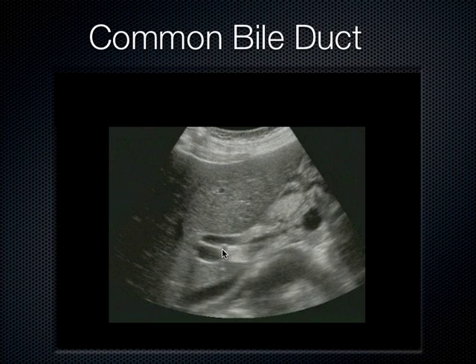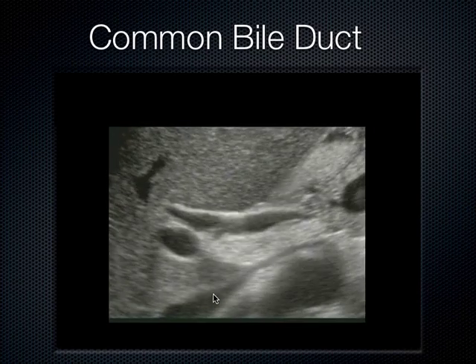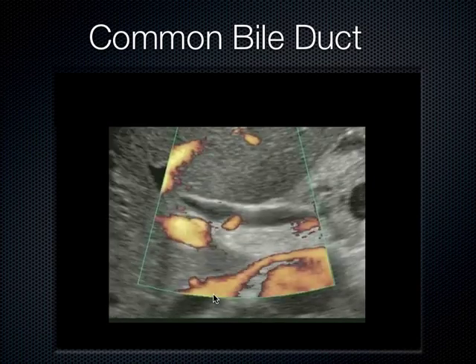That's hepatic artery. So we're seeing this. This is the portal triad right here. It's just looking right back at us. Anybody want to take a stab what this is down here? Good, IVC, exactly. So as this video goes along, we kind of zoom in, and then just for fun, we throw some flow on this stuff.